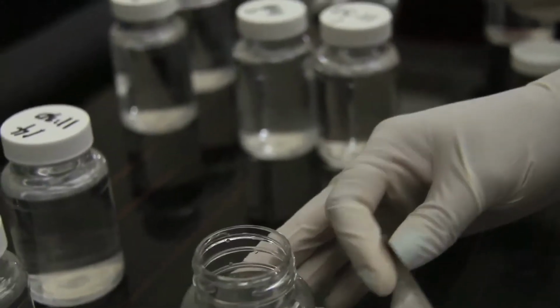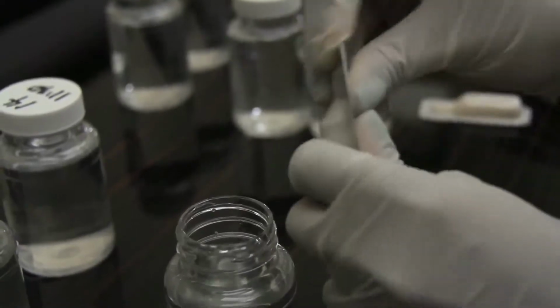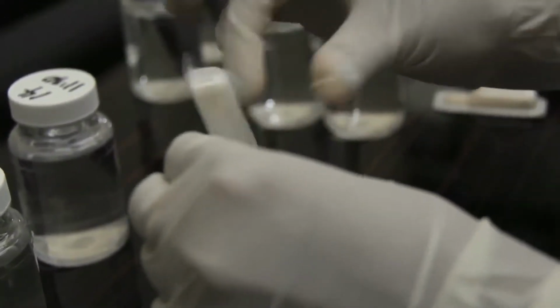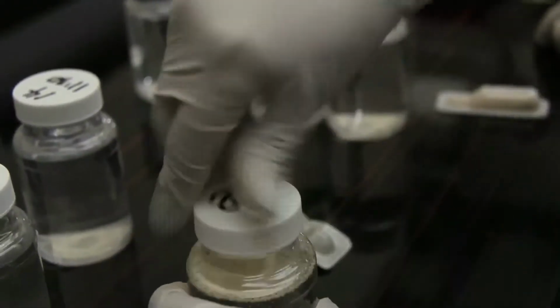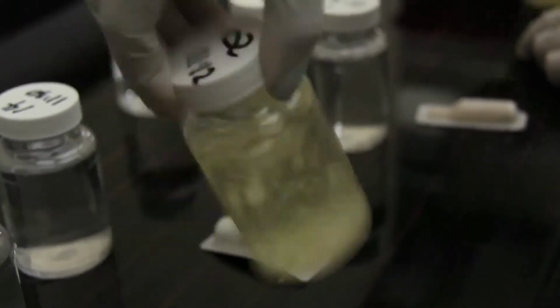First, we get this water sample and we get the Colilert, which is the reactant to tell if there are any coliforms. You open it like this and put the sample in there. Make sure you get as much as you can in there. Then you want to cap the bottle tightly and stir it this way, not shake it hard, because you don't want too many bubbles forming. You want to stir it until all the powder has dissolved into the sample.